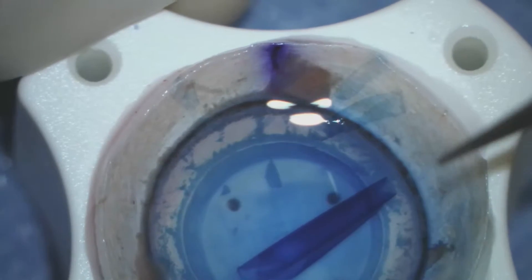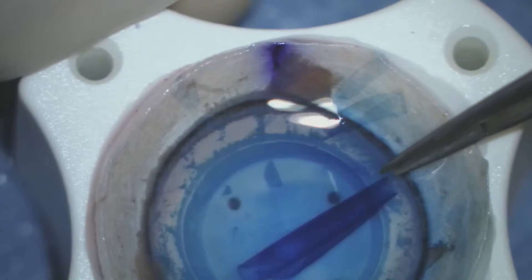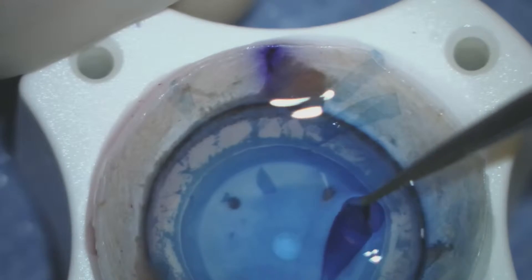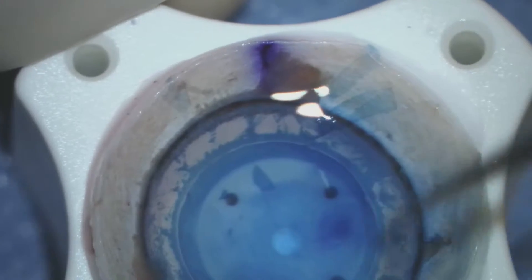We then transfer Descemet's membrane and endothelium, which are in the scroll, to a bath of balanced salt solution and place it into an IOL injector.